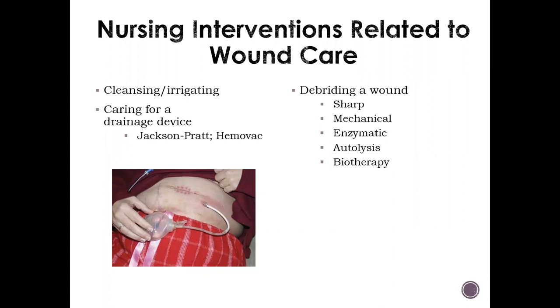An ideal irrigation pressure will range from 4 to 15 psi. To remove material adhering to the wound bed, we need to use a 35 ml syringe attached to a 19 gauge angiocath and deliver the solution at approximately 8 psi. Pressures above 15 psi will actually increase the risk of driving bacteria deeper into the tissue, and it can also cause mechanical damage.